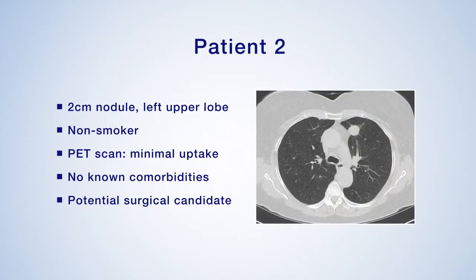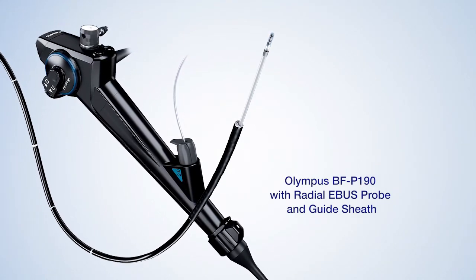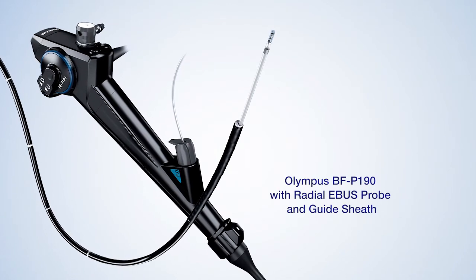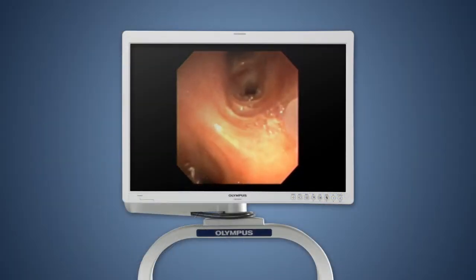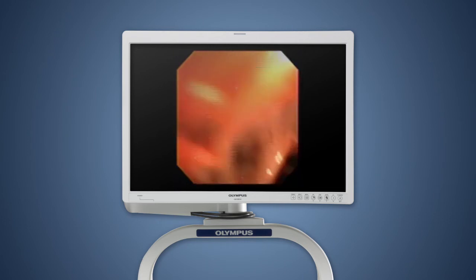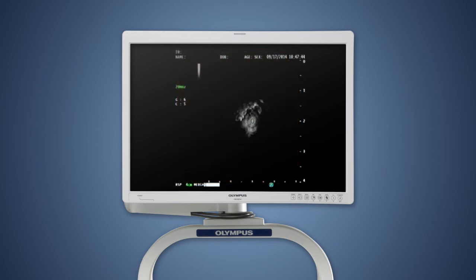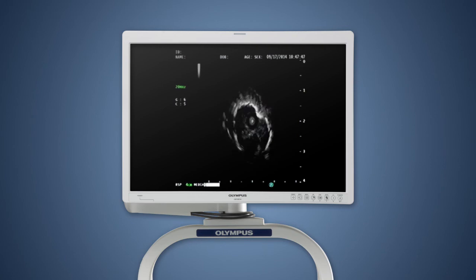The patient in our second clinical scenario underwent bronchoscopy with radial ebus for the left upper lobe nodule. Given the location of this lesion relatively close to the anterior chest wall, a 4-millimeter bronchoscope was used to identify a medial branch of the superior division of the lingula, and the radial probe was passed into the periphery using fluoroscopic guidance. Here you see the 4-millimeter bronchoscope in the distal left main stem bronchus with the tip of the radial probe exposed. The bronchoscope is then advanced into the superior division of the lingula where a medial and lateral branch are identified, and the probe is advanced into the medial subsegment showing a concentric view of the target lesion. Fluoroscopy provides an external view of the pathway taken to identify the lesion, in agreement with the planning performed prior to bronchoscopy using multiplanar reconstruction.